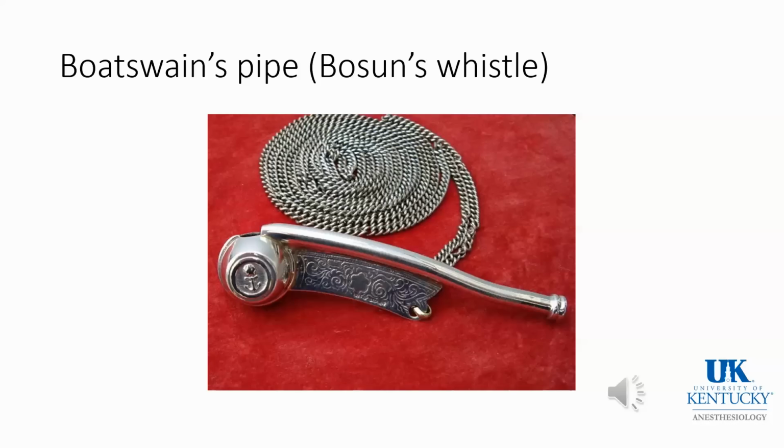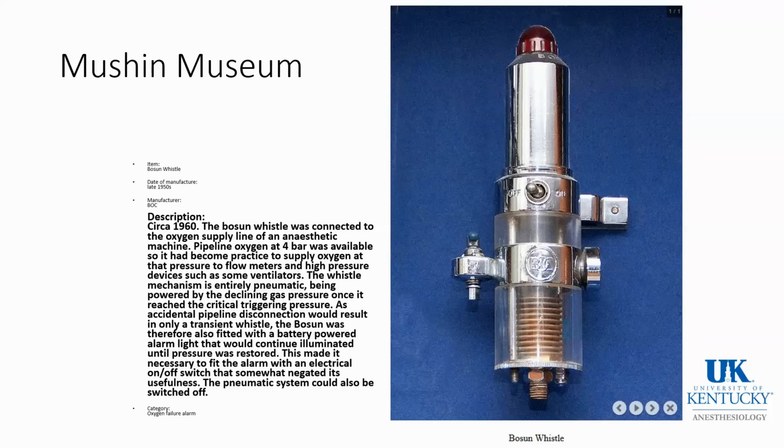and it is used to give commands on ships, and this is what the oxygen failure alarm system sounded like in days gone by, when the primary oxygen alarm was the Bosun's whistle. But just like that short sample, it didn't go on for a long time, and you had to be ever listening for oxygen failure.